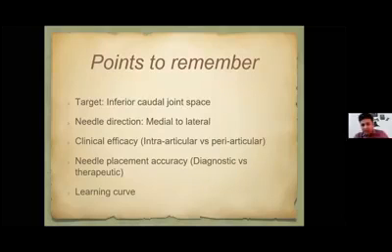So, lastly, some points to remember. Try to target the inferior caudal joint space, for the young pain physicians who are starting. Needle direction is from medial to lateral, because of the orientation of the sacroiliac joint.